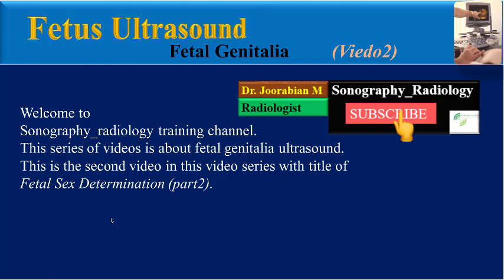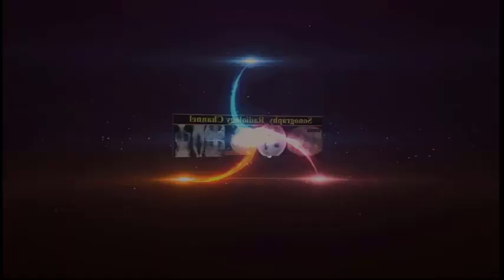This series of videos is about fetal genitalia ultrasound. This is the second video in this video series with the title of Fetal Sex Determination Part 2.